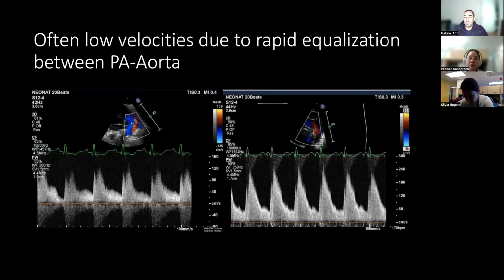And that's why the speed at which this jet is coming out is much quicker. It's a high velocity because the pressure difference between the two environments is big, right? The pressure builds up in your hose because you're blocking the flow of water, and it's trying to get into the environment, which has atmospheric pressure. So it's a huge pressure gradient.